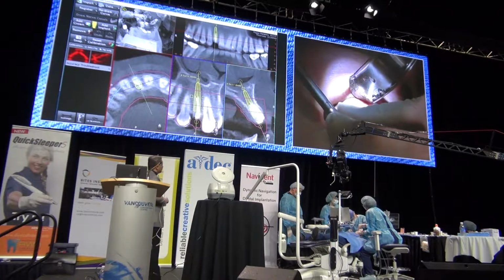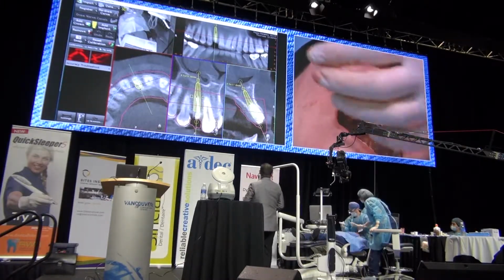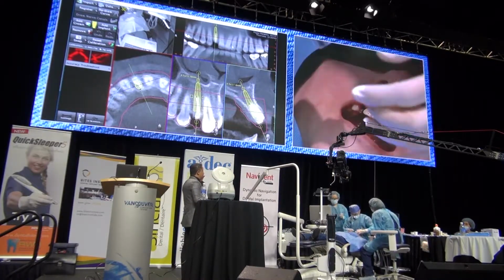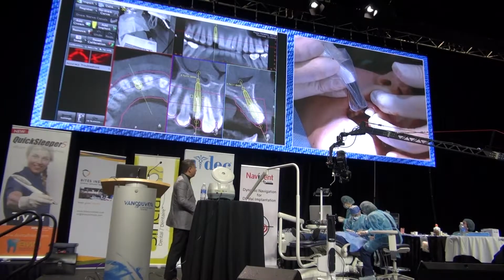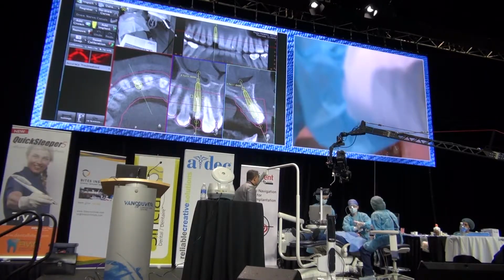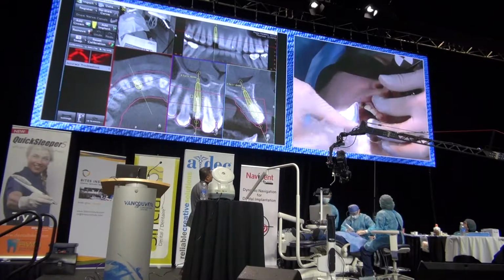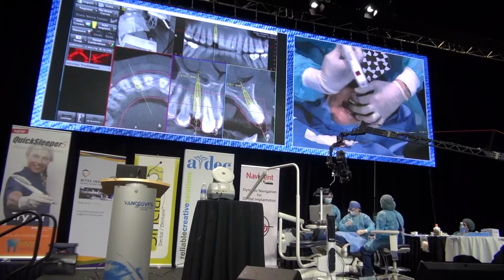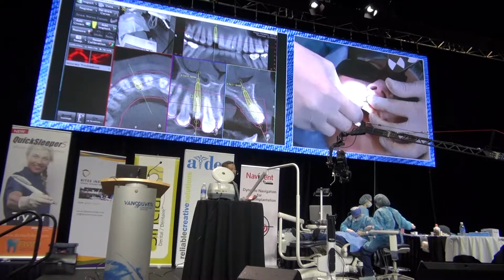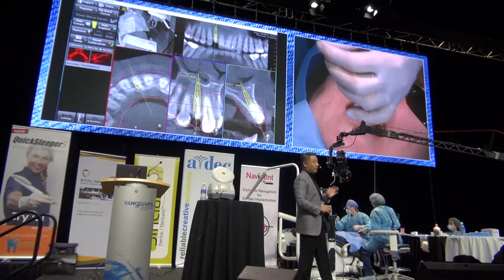Now Dr. Kwan has put on something called a multi-peg, specific to this implant diameter and size. We're going to take what we call an ISQ reading with a Penguin. What are we getting? We can't see it on the camera. What are you getting? 66. So on one end it is 66. On the palatal, what do we get? 70. That confirms we locked the implant in with primary stability, or what we also call initial fixation. So it's great. We've locked the implant in mechanically.